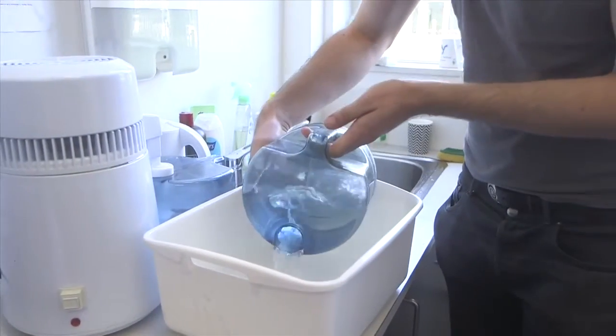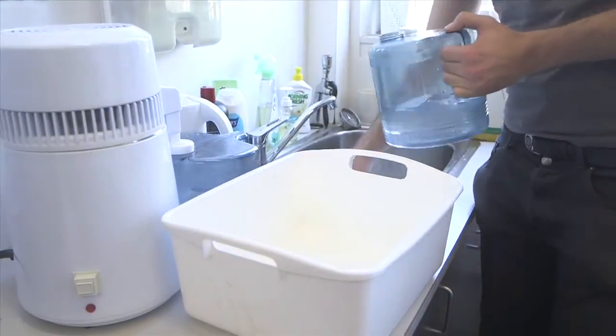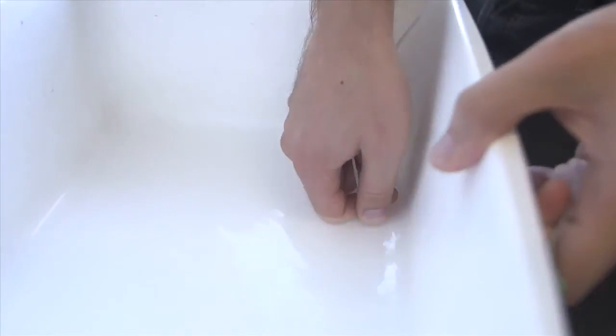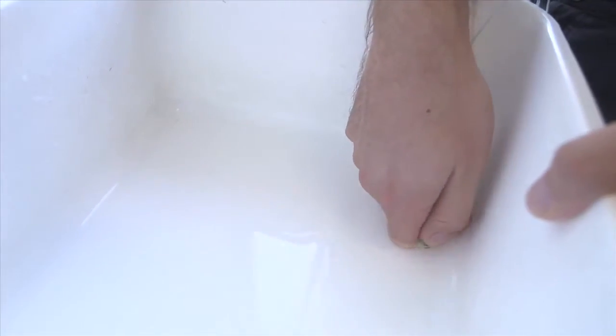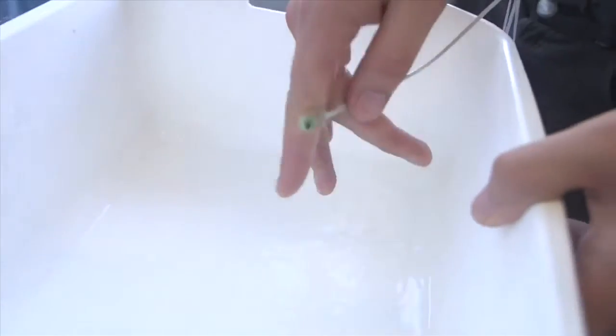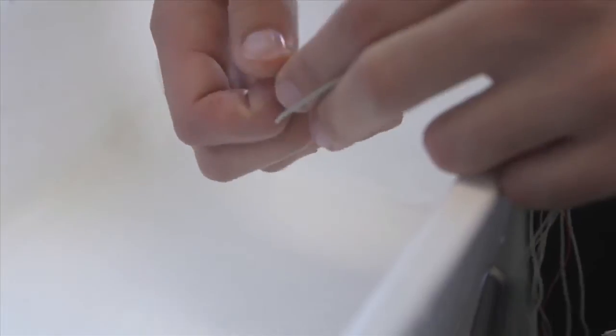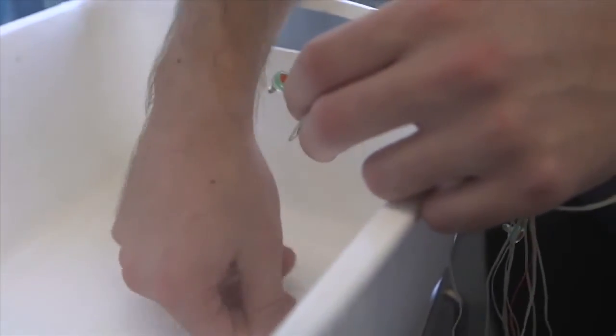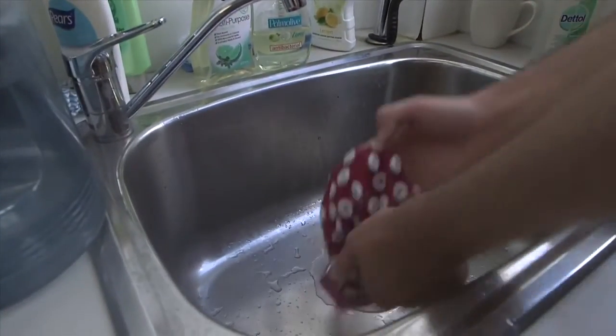We're now ready to clean the electrodes. Fill the white basin with 2 to 3 centimeters worth of distilled water. When cleaning the external electrodes, gently rub them with your finger to ensure that all the gel has come off, but be careful not to scratch them with your fingernail. Clean the electrodes one by one by wetting your fingertips and gently using them to clean each electrode. Make sure there's no leftover gel and that all the cables are untangled.